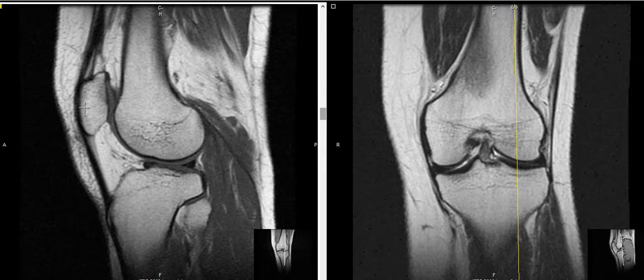This is the front, the kneecap, as it glides along here in the front of the femur. There's no abnormality here in the front. This is the anterior knee compartment. The quadriceps and patellar tendons that come off the kneecap look great.